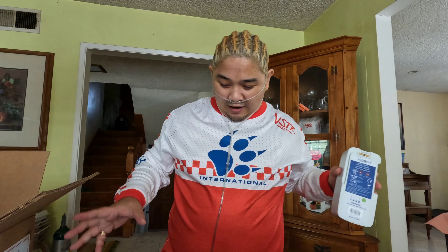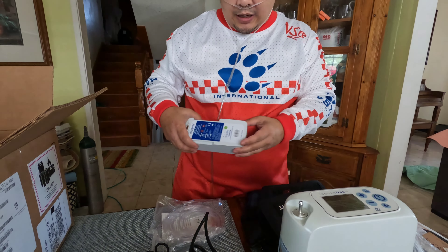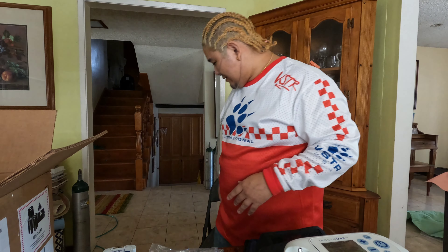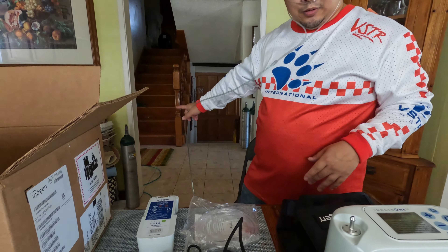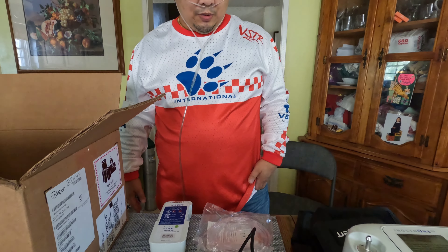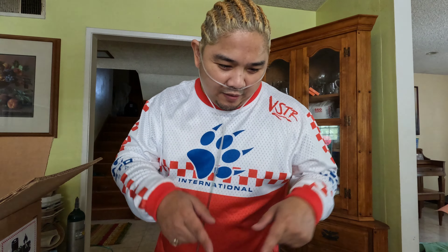These are all the items that came in this package and it costs about $3,400. I've been using those scuba diving oxygen tanks, and it's been a real hassle going to the casino like that. So I decided to go with something a little bit ninja style — and it's this. This is just the unboxing of the Inogen Concentrator. I will have a second video coming soon about the actual product. But until then, vlog.